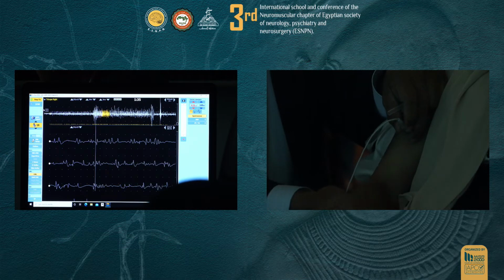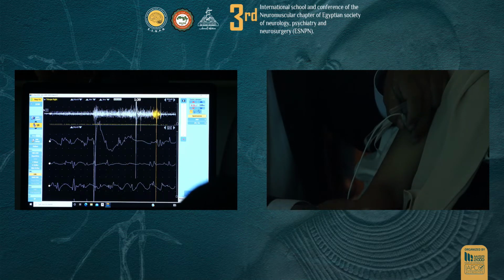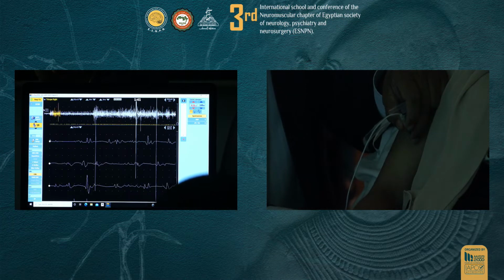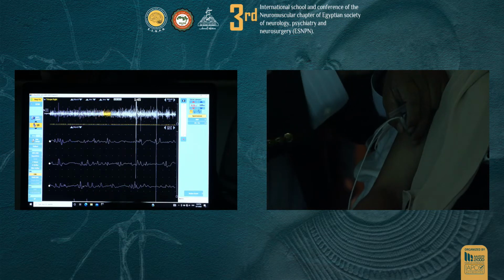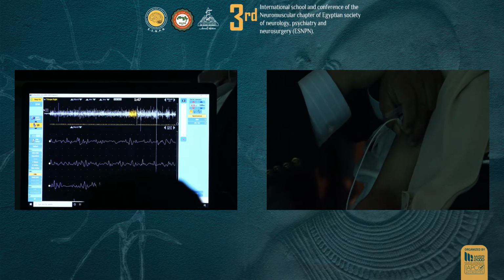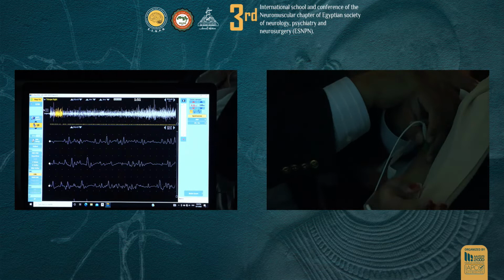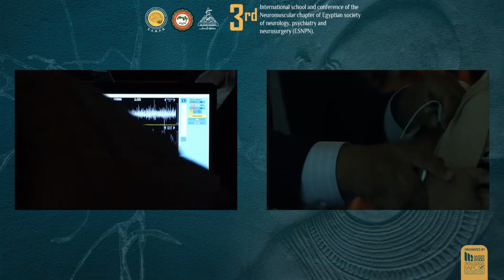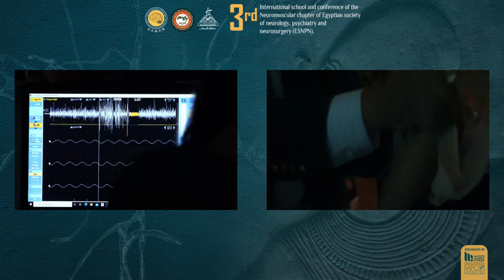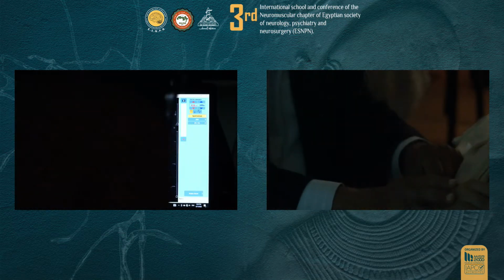Okay, I wanted to show you insertional activity as well, if I can get her to relax a bit. Can we put this machine down a little bit? We'll just put you down flat, a little bit. Just relax. Put your hand down. Yeah, just down, like that. Just let it drop. Good. Excellent. Just let it loose, okay?